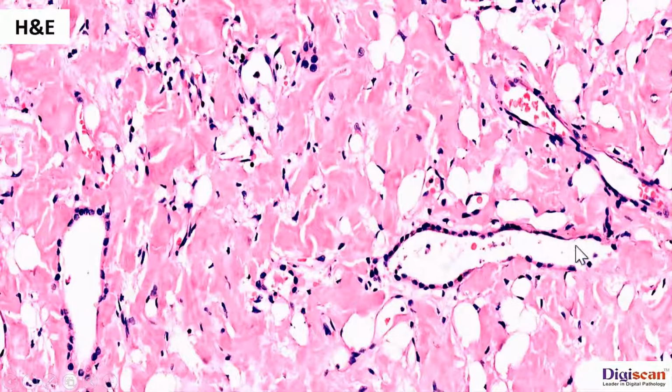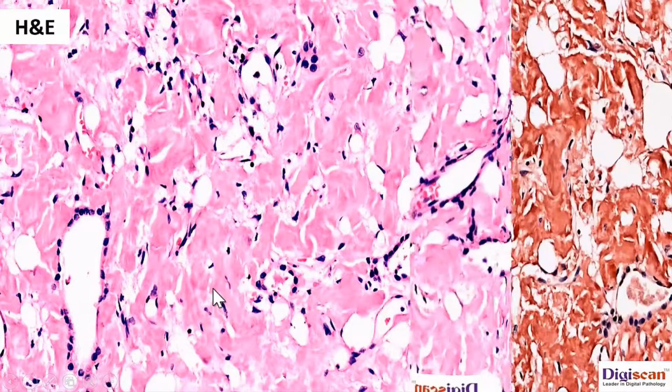Some of them are cystically dilated and have no intraluminal colloid. The thyroid follicles were also reduced in number. There is intercellular deposition of an amorphous pinkish hyaline material.